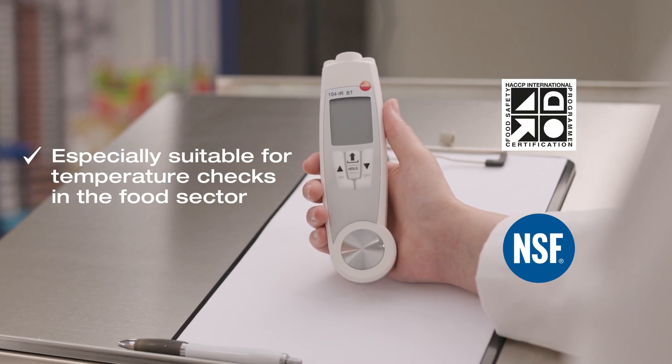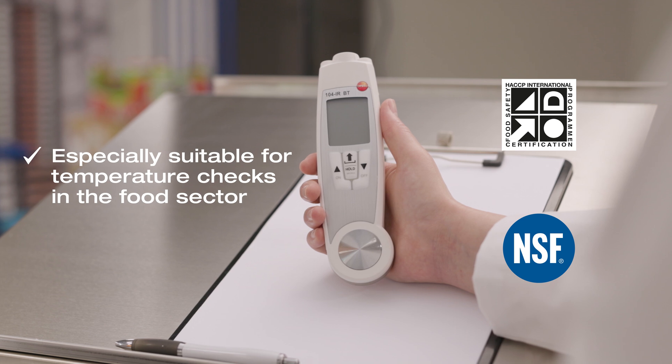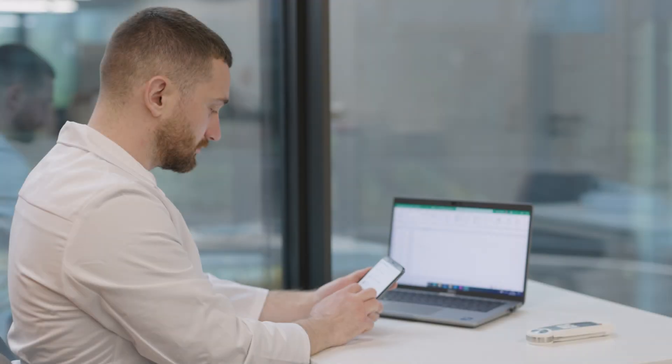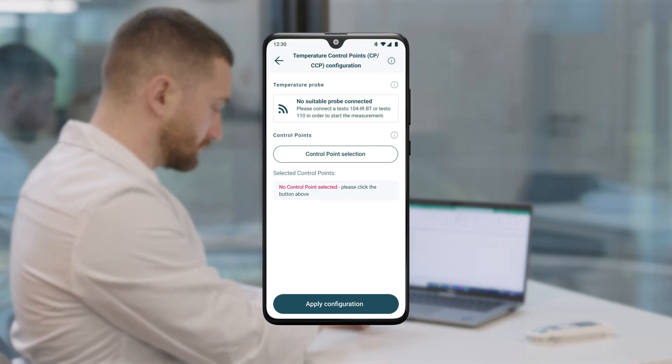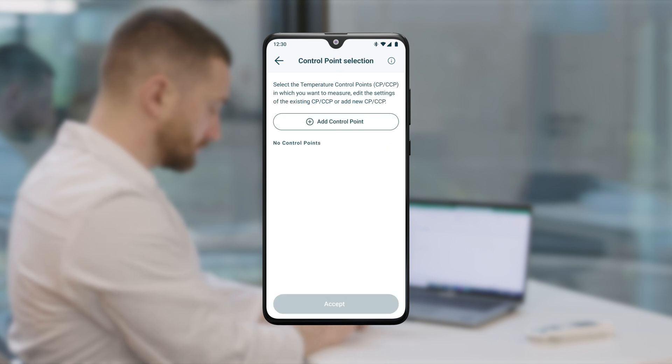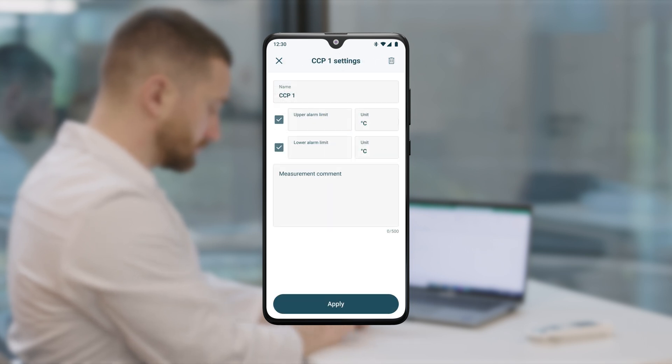The measuring instrument is particularly suitable for temperature checks in the food sector, as it is certified according to the strict standards of HACCP and NSF. Before the actual measurement begins, measurement points for critical control points can be created in the Testo Smart App and provided with alarm values and comments. Alarm limits can be defined for each measuring point, which enable automatic interpretation of the measured values by means of colored markings.